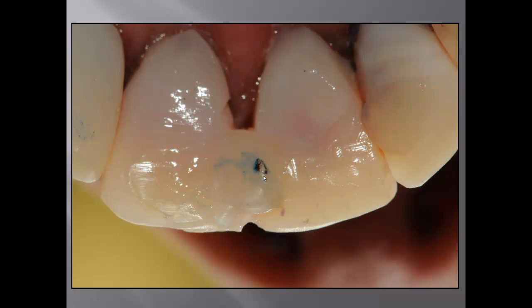Why is it so important? It's important for me to deprogram the patient to make sure that I find the reference point, or the original position of the lower jaw of the patient. I'll ask the patient to open and close her mouth for the next 15 to 20 minutes. And when I come back, I want to see that this spot is repeatable. If this spot in 15 to 20 minutes is repeatable, it means the patient is deprogrammed.